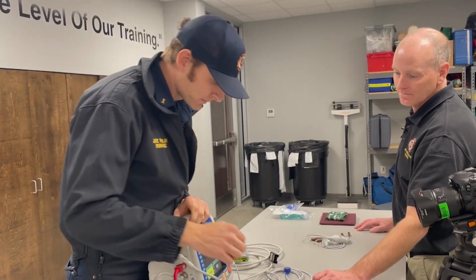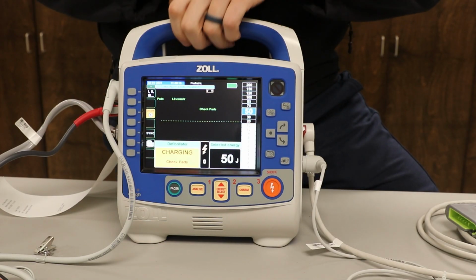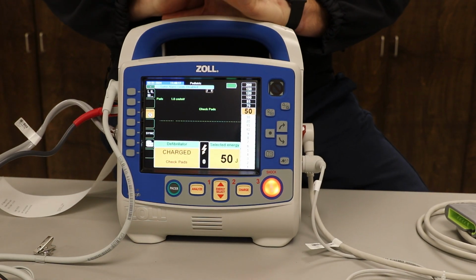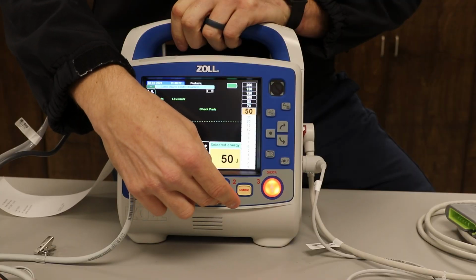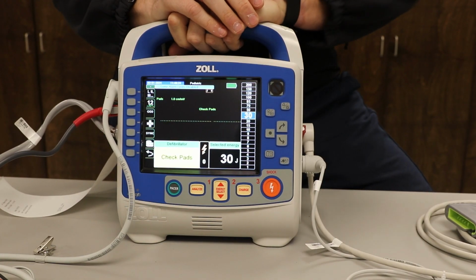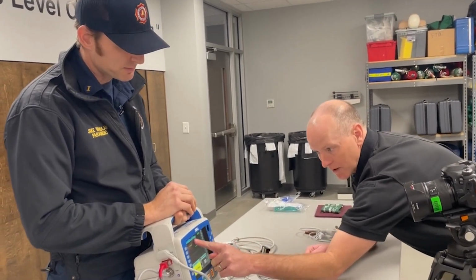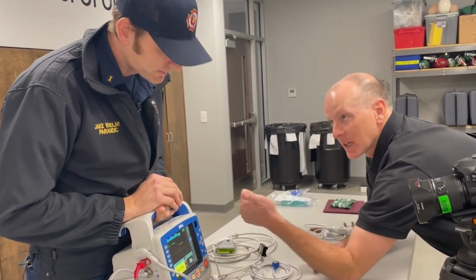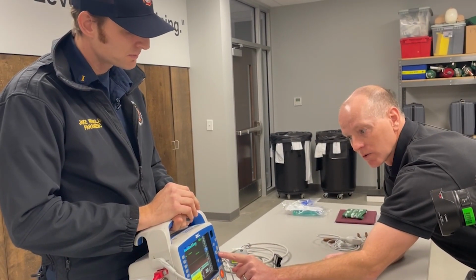The other way, if we go through energy select, charge, we're at the point where we could potentially charge if we need to. However, we need to disarm. The other way to do it, energy select up or down, it'll disarm it. So highlight 2 things. We need to make sure that if we're going into an AED mode, we need to be pediatric or adult. To go over, all we do is highlight the arrows.